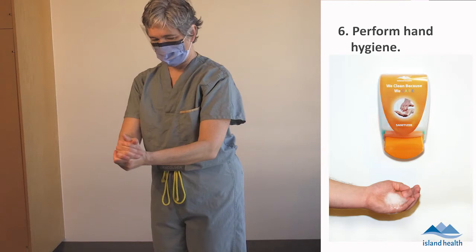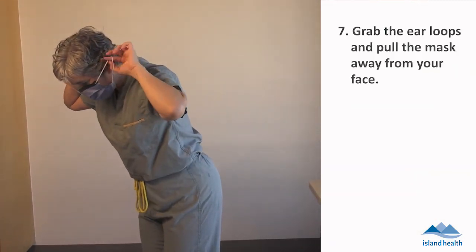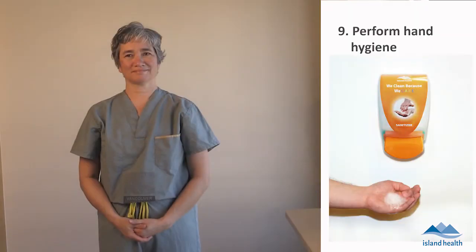Perform hand hygiene. Grab the ear loops and pull the mask away from your face. Without touching the outside of the mask, dispose of the mask. Perform hand hygiene.